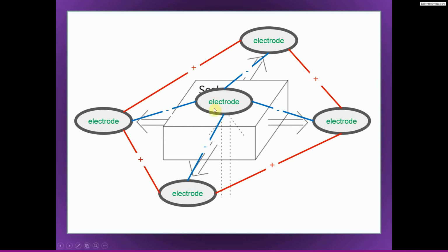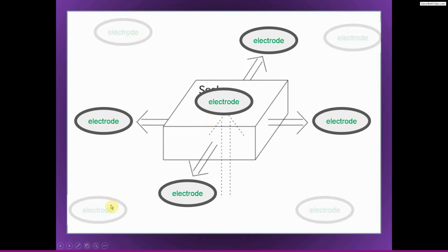But of course, there are two limitations here. One is that we have more electrodes on the head, lots and lots of electrodes, dozens or maybe even a few hundred. Another limitation is that the spread of the voltage, the spread of the electrical field, is going to decrease as a function of distance.